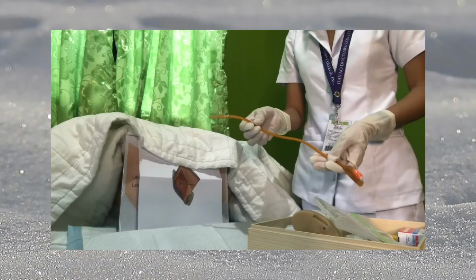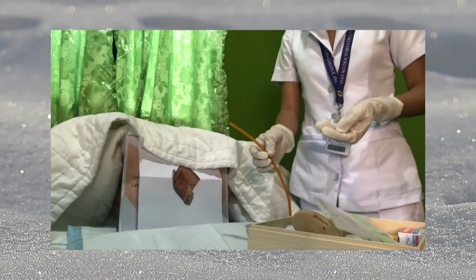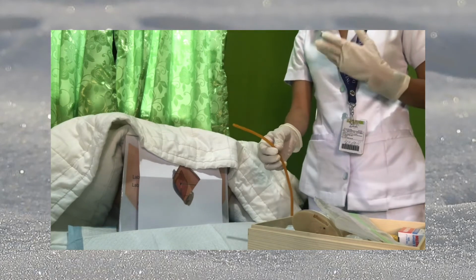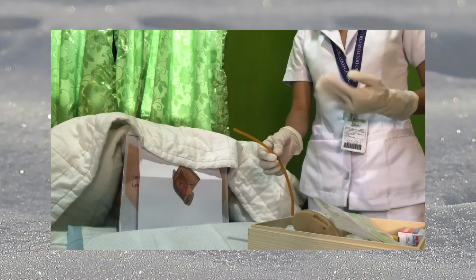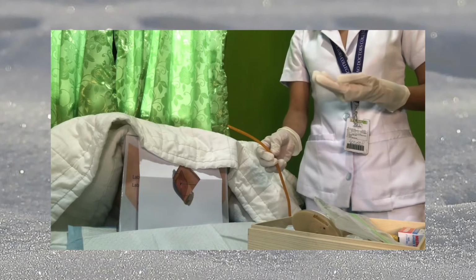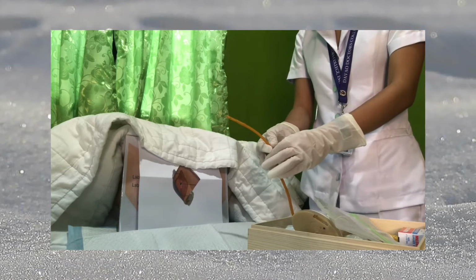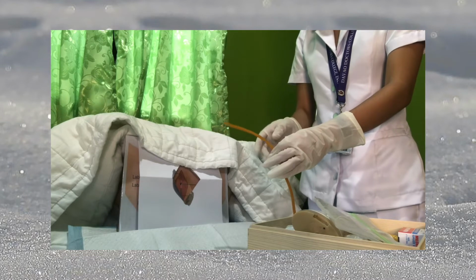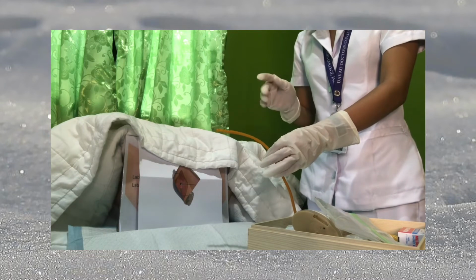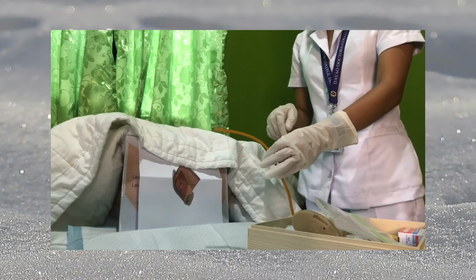Now pick up the catheter about 3 inches from the tip with the thumb. Place the thumb and one finger of the left or right hand between the labia minora, then separate and pull up gently, because separating the area immediately surrounding the meatus helps make it visible. Now, insert the catheter into the meatus 2 to 3 inches or until urine begins to flow. The female urethra is approximately 1.5 to 2.5 inches.